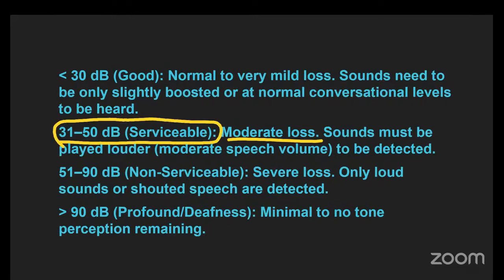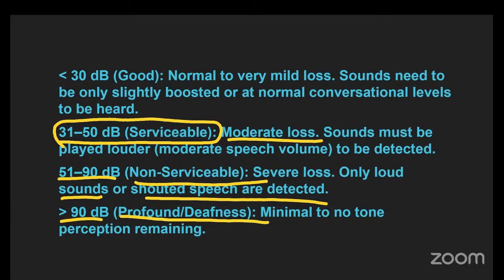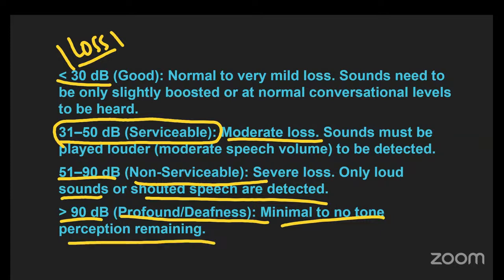This is moderate loss. The sounds need to be played louder if you want any meaningful speech to be understood or recognized. 51 to 90 decibels is non-serviceable. This means the patient has severe loss, and only loud sounds or shouted speech are detected. More than 90 decibels means there is profound deafness. Please remember this is a measurement of loss. So if there is a loss of more than 90 decibels, this means minimal to no tone perception remaining at all.